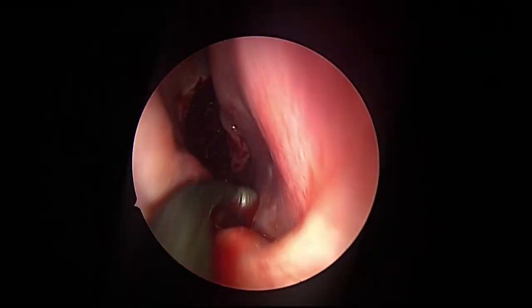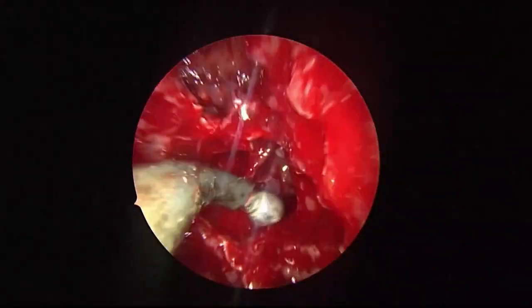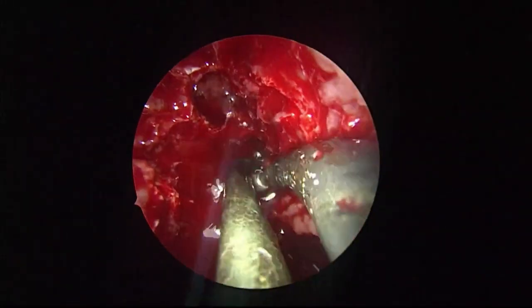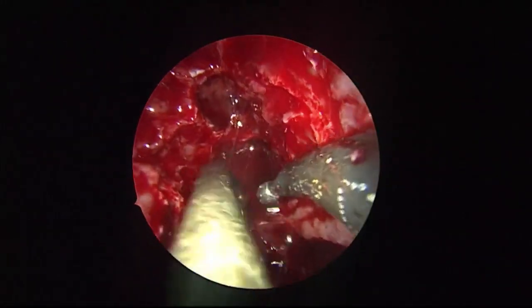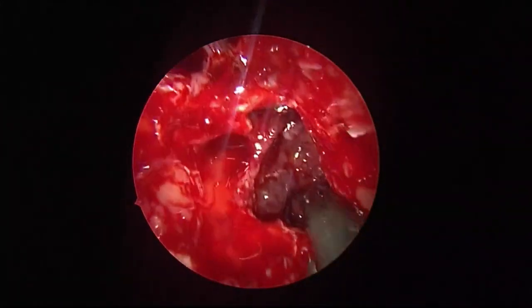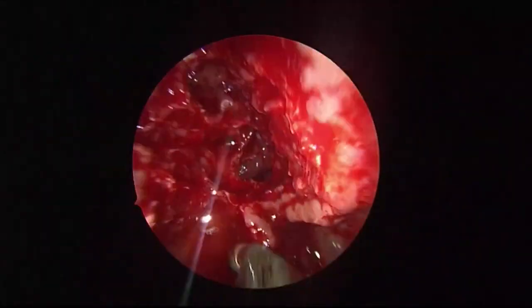Pardon? Middle turbinate. Yeah. I will resect partly in the end. Why not earlier? Earlier we were using it as a landmark. Still, we are removing only the inferior parts. Yeah. I will remove it now.